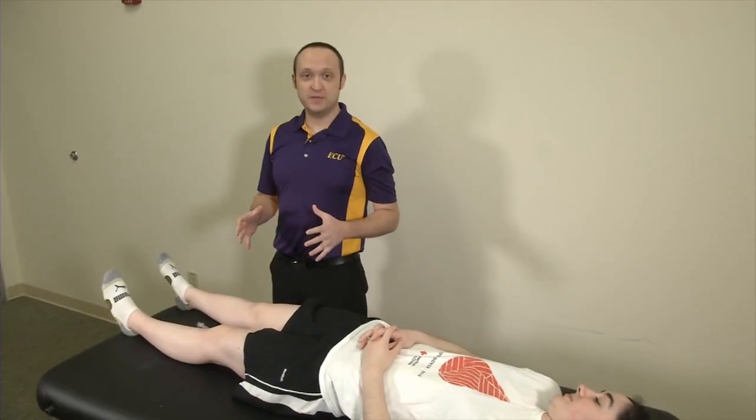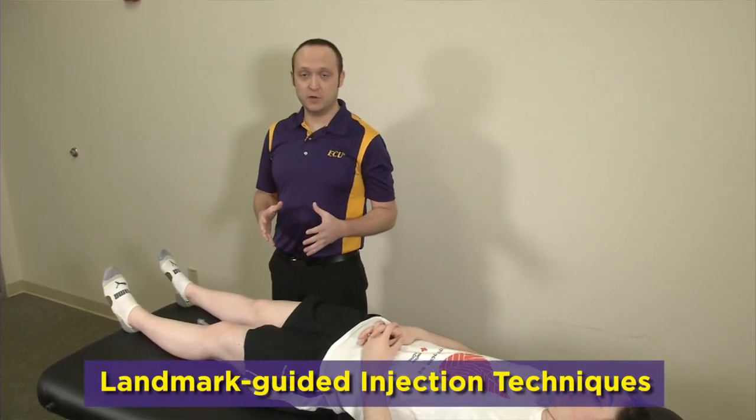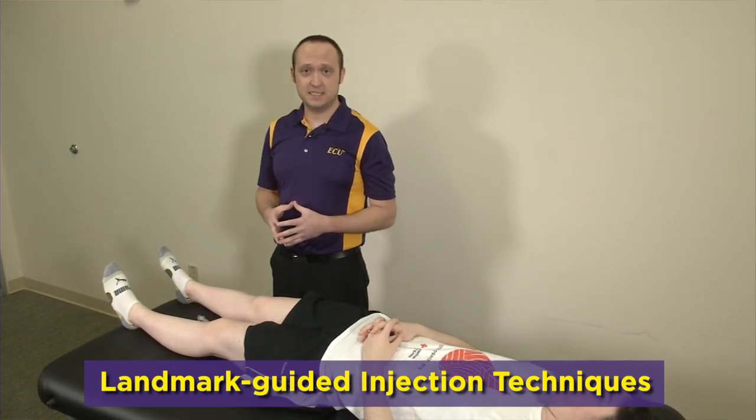Finally, welcome to video number five. This is going to be joint injection techniques. We're going to be going over three different approaches for injecting into the knee.